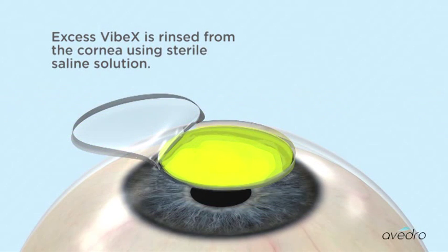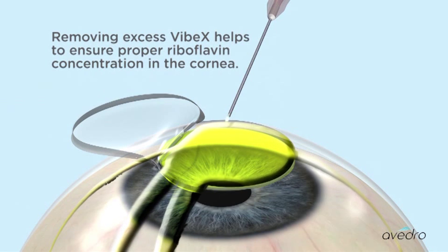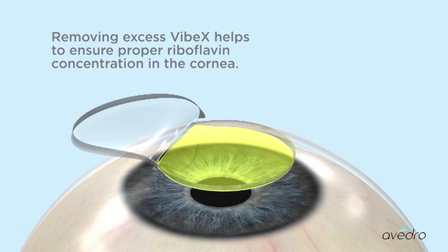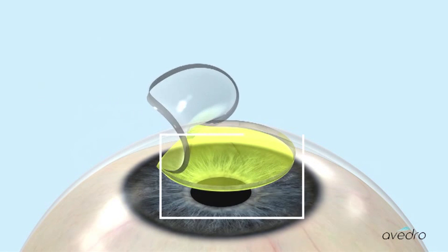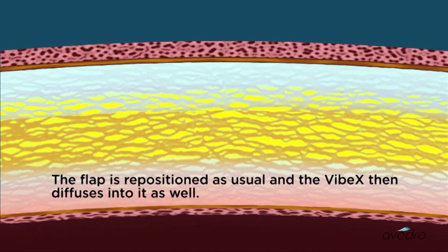Excess Vibex is rinsed from the cornea using sterile saline solution. Removing excess Vibex helps to ensure proper riboflavin concentration in the cornea. The flap is then repositioned as usual, and the Vibex diffuses into it as well.